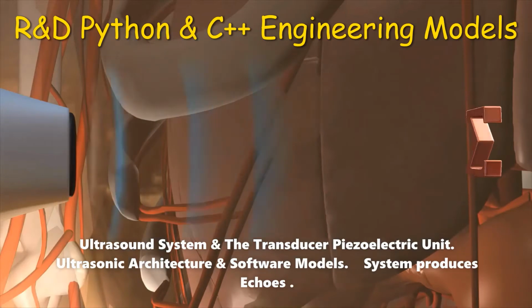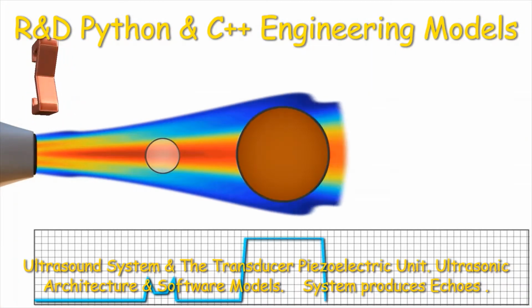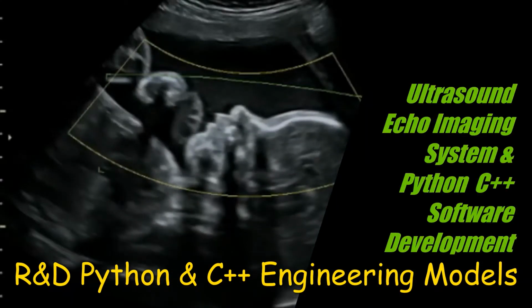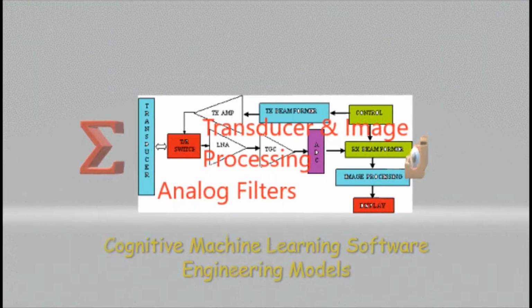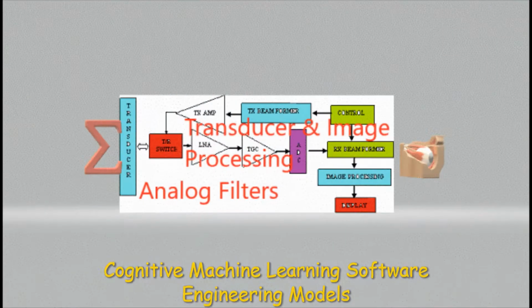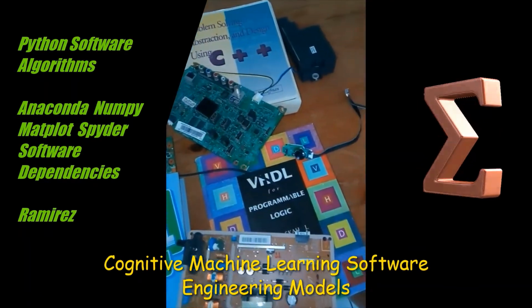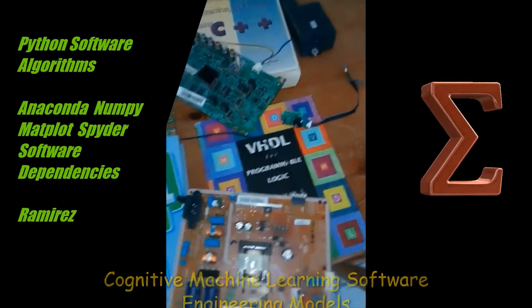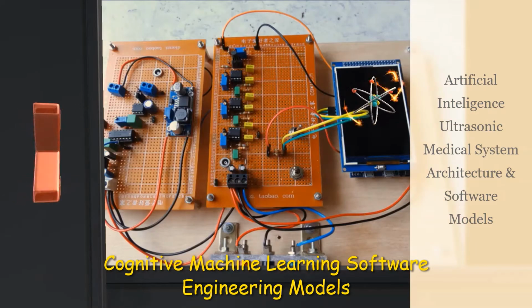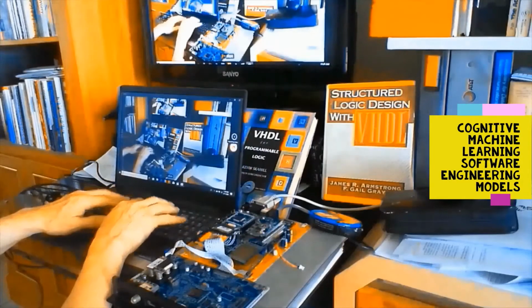When used in an ultrasound scanner, the transducer sends out a beam of sound waves into the body. The sound waves are reflected back to the transducer by boundaries between tissue in the path of the beam. That is the boundary between fluids and soft tissue, or tissue and the bone.